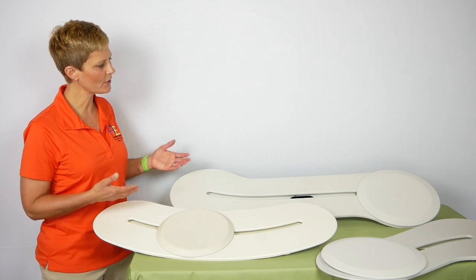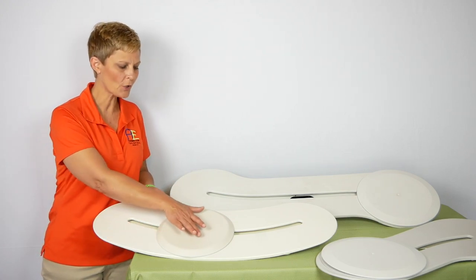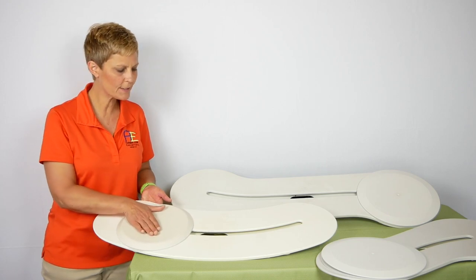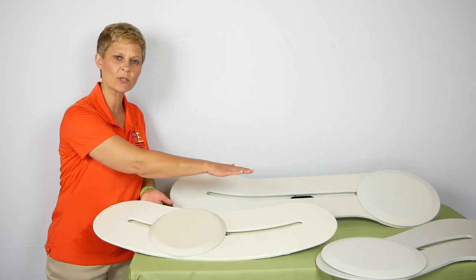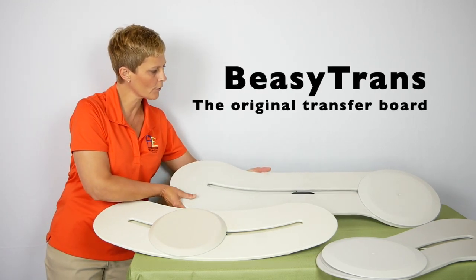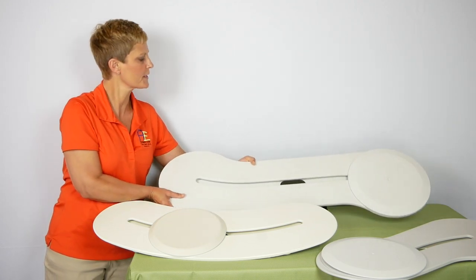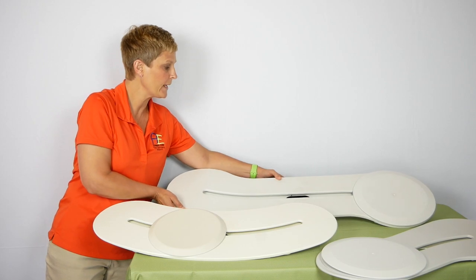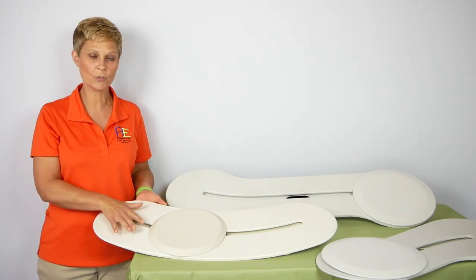These are the three styles of BZ Boards that have the disc-shaped sliding seat. This disc or seat slides across the board so the user sits on that and glides across the board for the transfer. This is the original BZ Board — it's a little bit longer and is often used for a longer surface-to-surface distance, for example getting in and out of the car.